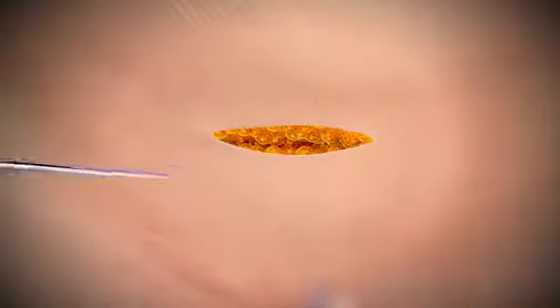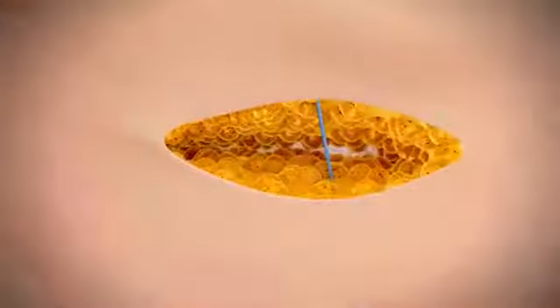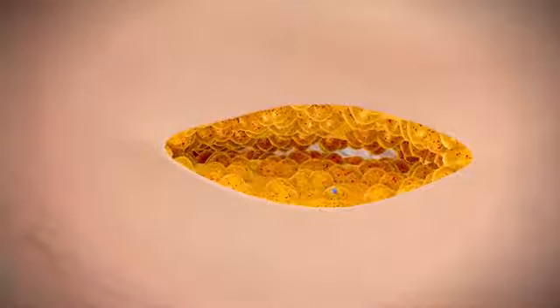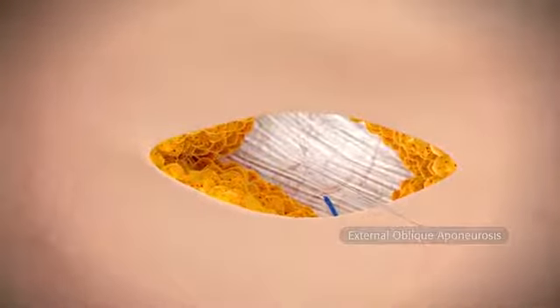Incise the marked skin down to the level of the subcutaneous tissue. If present, identify and cauterize the superficial epigastric vein, which will be present in the majority of patients. Continue sharp dissection to the level of the external oblique aponeurosis.